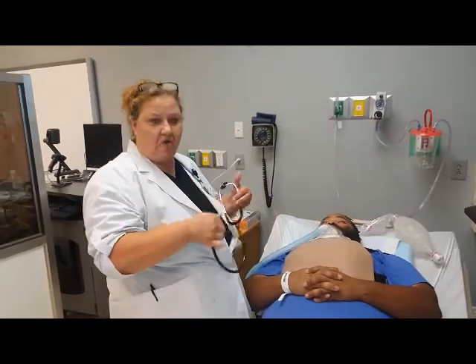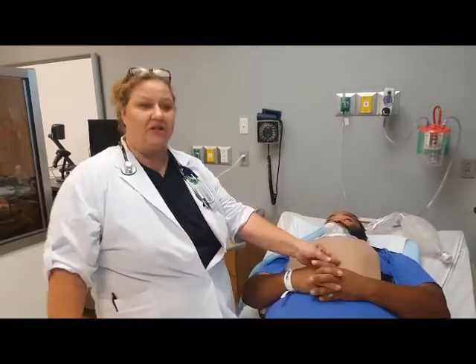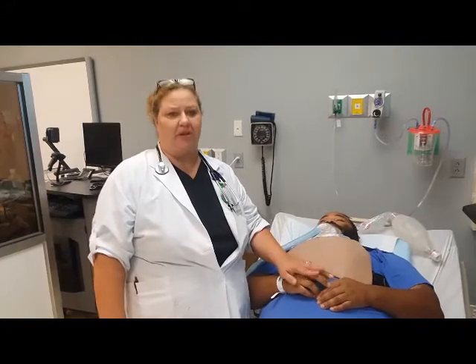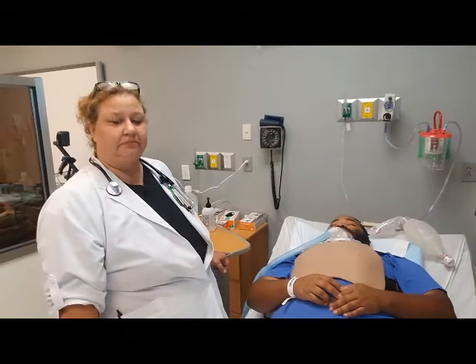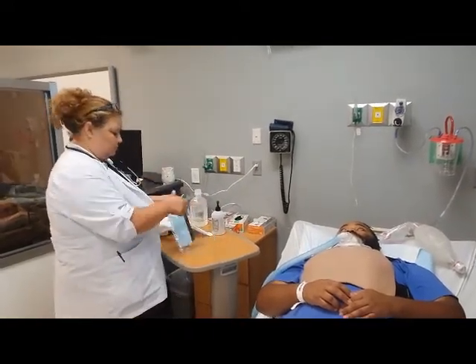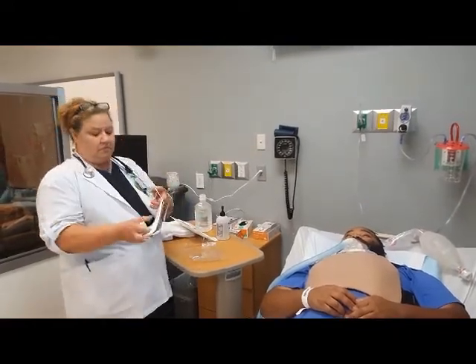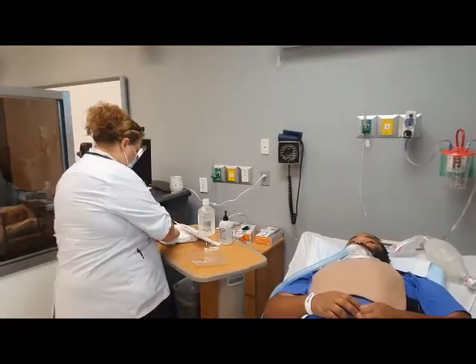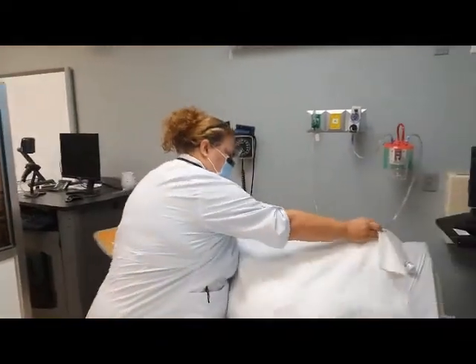You will verbalize the heart rate. You will verbalize that you have done all those things and that you've checked capillary refill, heart rate, blood pressure, and the patient is safe to have suctioning done. Then you don your mask with the eye shield. Lift their chest with the towel. All right, I'll drape this across you.